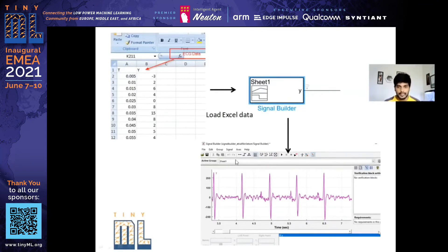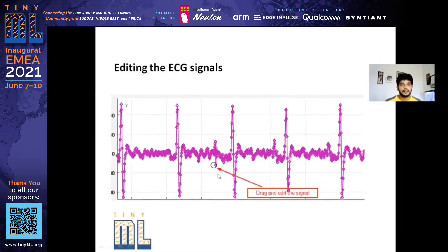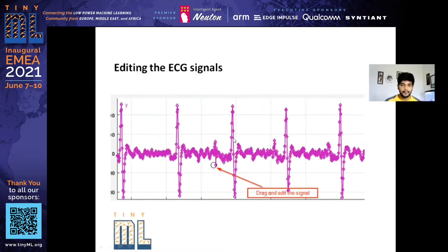In the Signal Builder you can see the normal ECG. It is equally distributed and there is no difference between P to QRS samples. Once I had my data in the Signal Builder, I began the editing process.